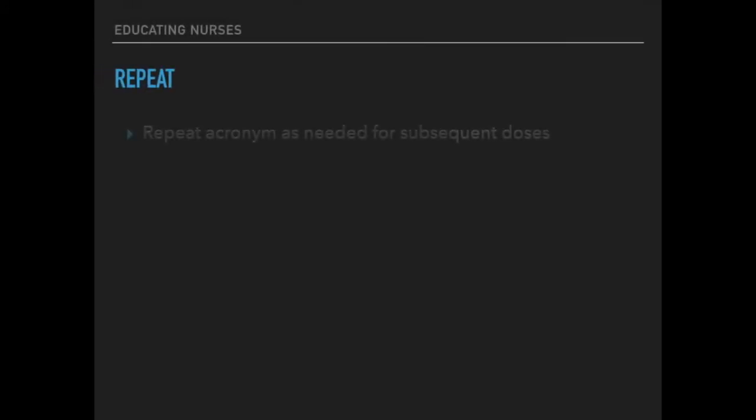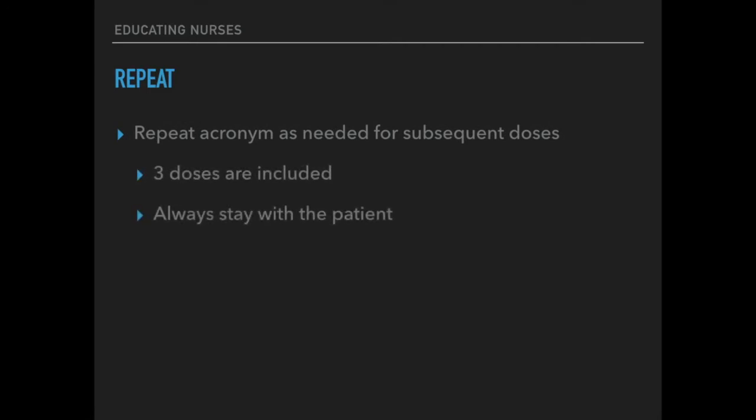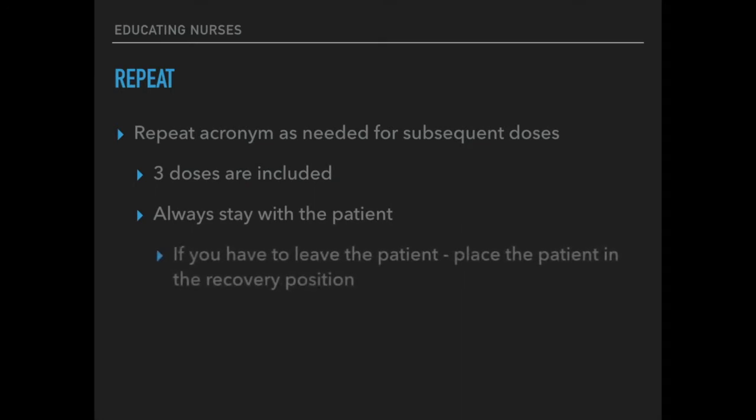Repeat the acronym as needed for subsequent naloxone doses. 3 doses are included. Always stay with the patient. If you have to leave the patient, place the patient in the recovery position.